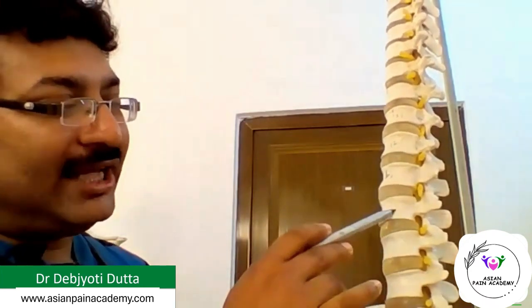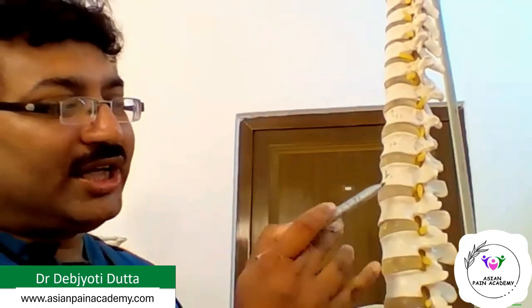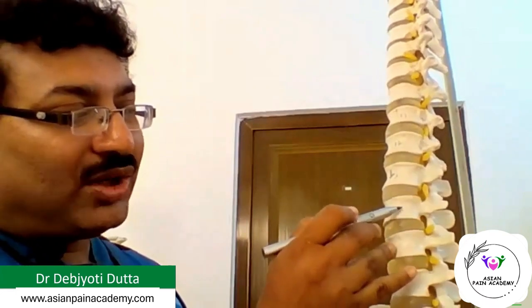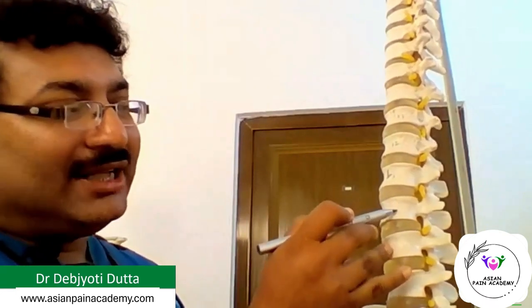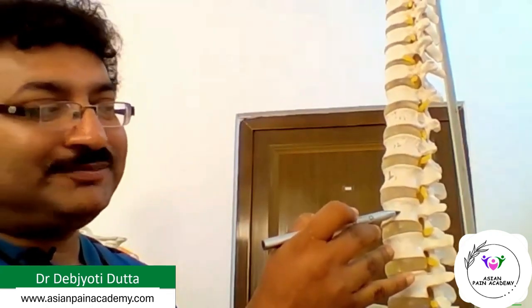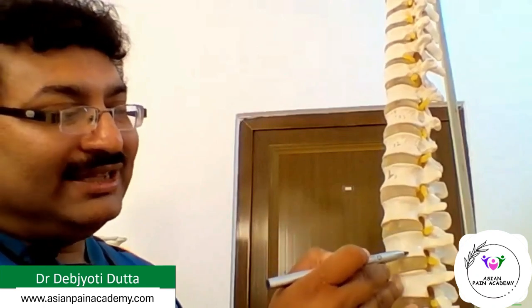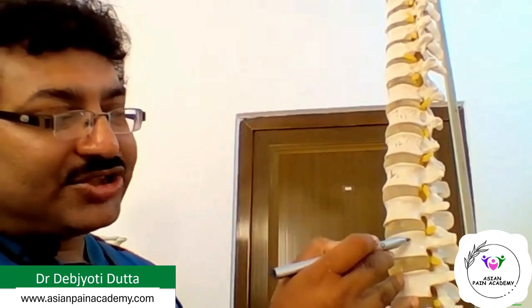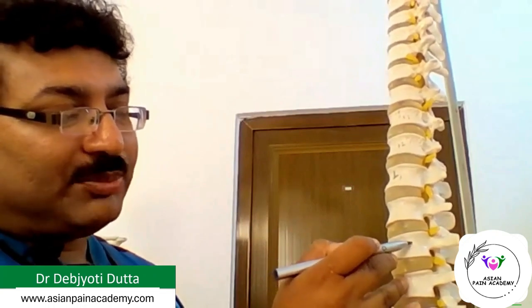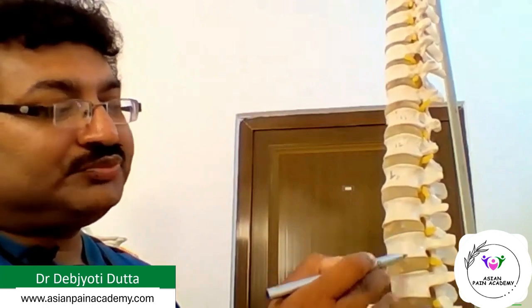That means the ganglion at the L2 level is situated at the junction of upper 2/3 and lower 1/3 of the height, and it is at the anterolateral corner of the vertebral body, like this place. Similarly, the ganglion at the level of L3 is situated at the junction of the upper 1/3 and lower 2/3 of the vertebra, and it is also situated at the anterolateral corner.